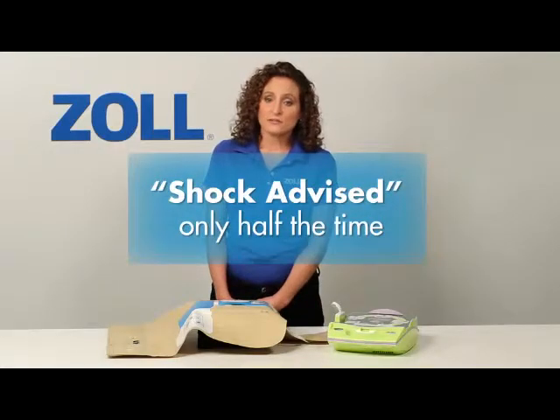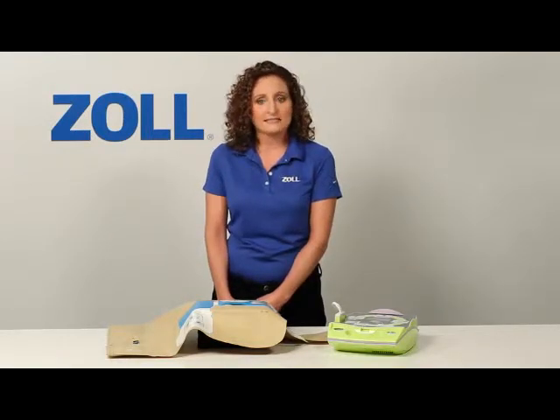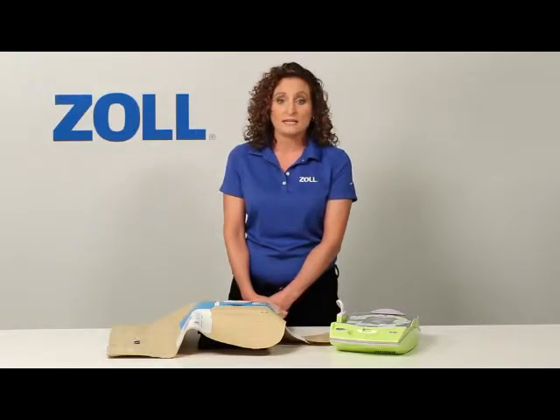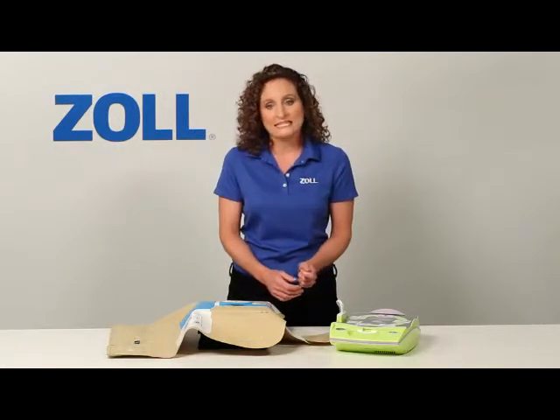Half of all rescues with an AED start with no shock advised. Perform good CPR with chest compressions that are at least 2 inches deep at a rate of at least 100 per minute, and the next analysis may tell you to deliver a shock. The AED Plus repeats the prompt to start CPR every 10 seconds. Because our AED has a technology called Real CPR Help, the AED Plus sees that I've not yet begun chest compressions. When I start, it will see my compressions and will help me do good CPR in a way that no other AED can.